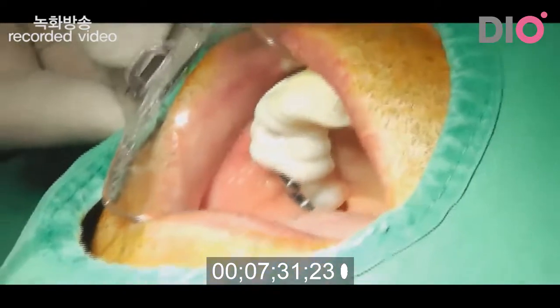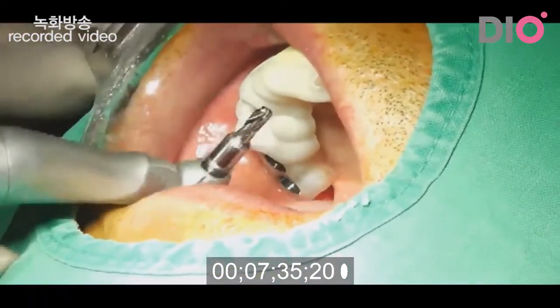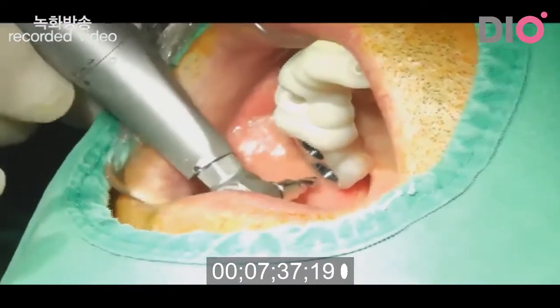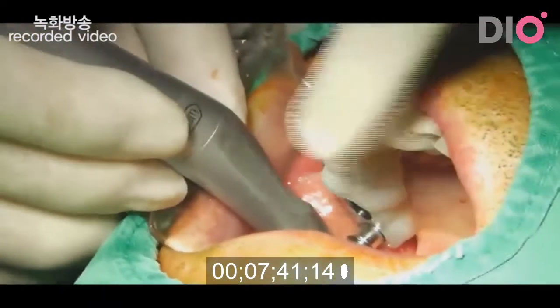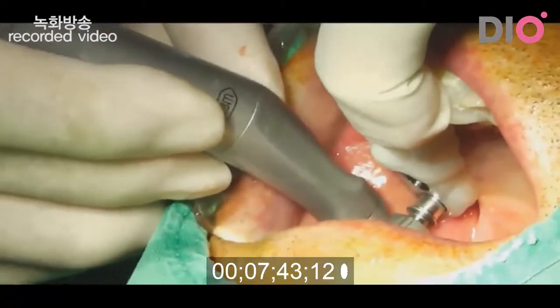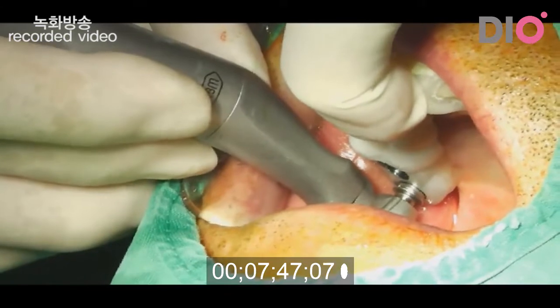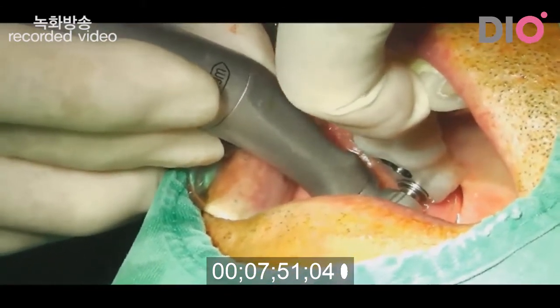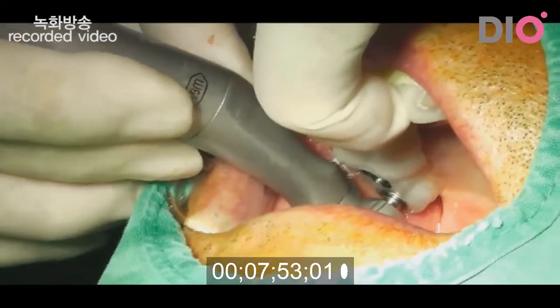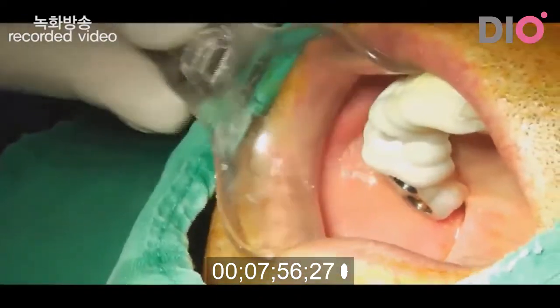Okay. This is a sinus drill. I will drill a little bit deeper, 1 millimeter deeper into the sinus cavity. Okay, I drill until the stopper touches the tube.